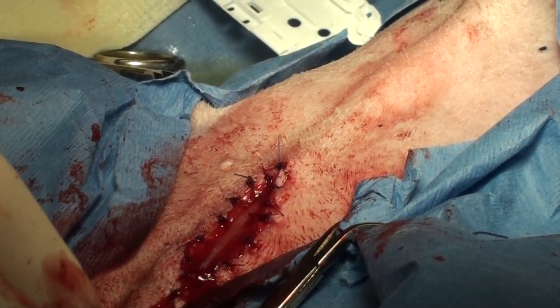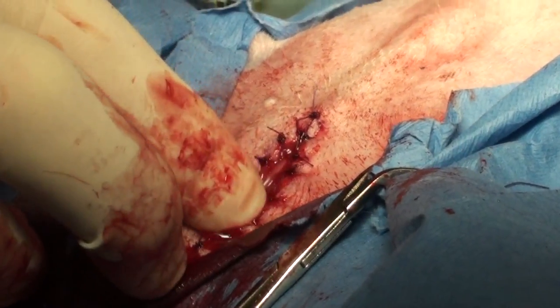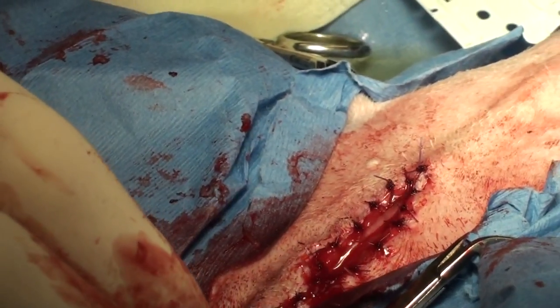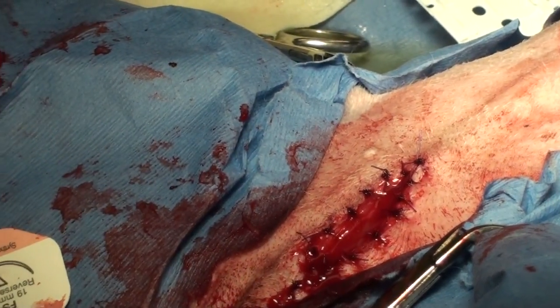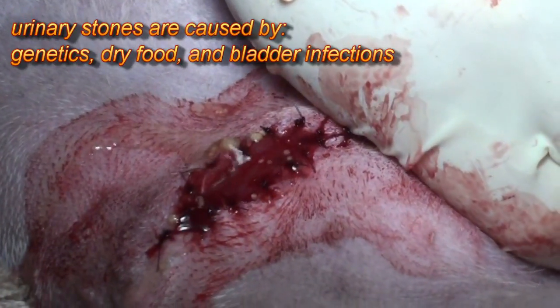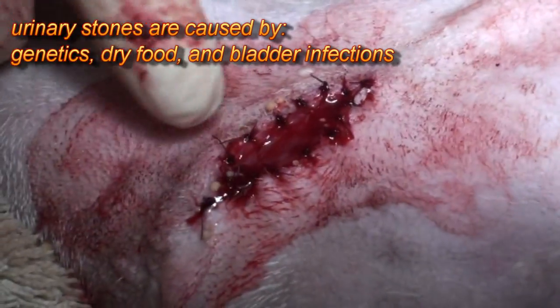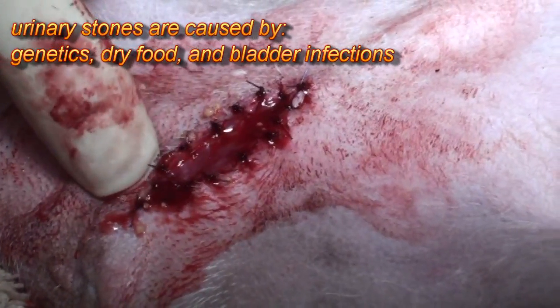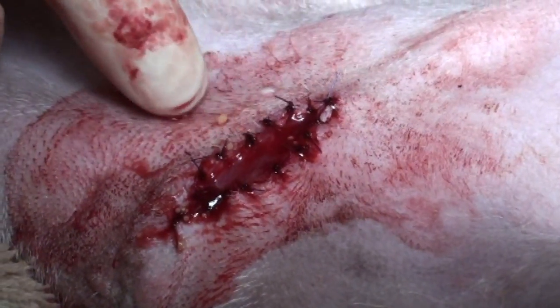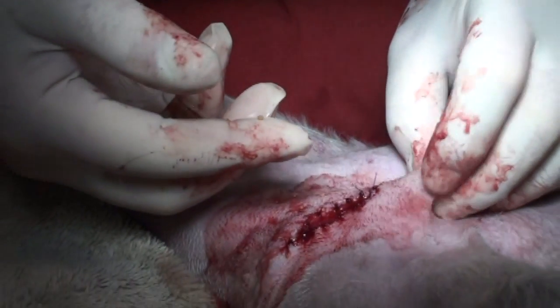The catheter is now coming out the end of the penis, so you can get an idea of what's happening. We can go back into the urethra, and then we're going to push on the bladder and see if we can get the rest of the stones out. You can see the little stones coming out now — those are the ones that are going to be passed. This is a case where it's not huge stones, but a whole bunch of them are getting blocked at the end of the bone of the penis.